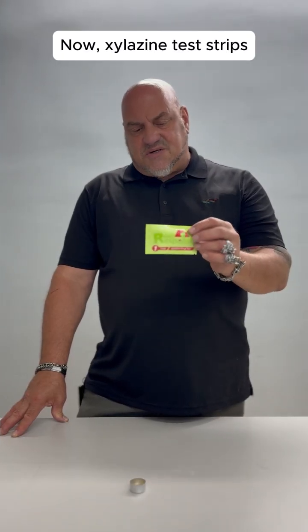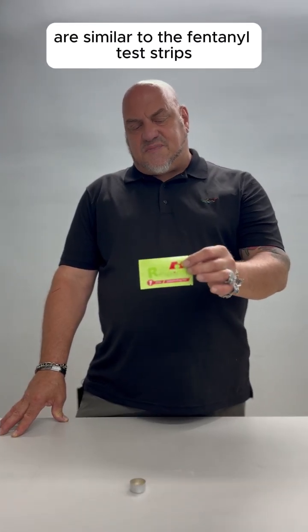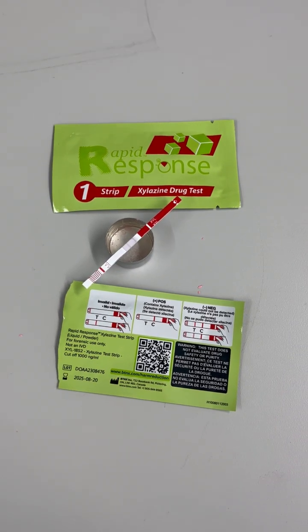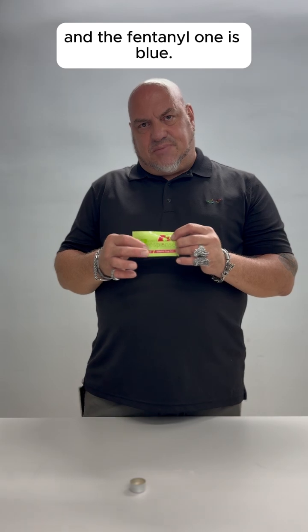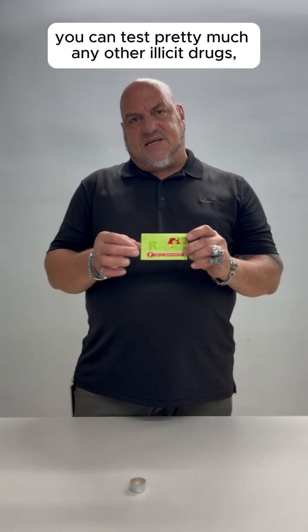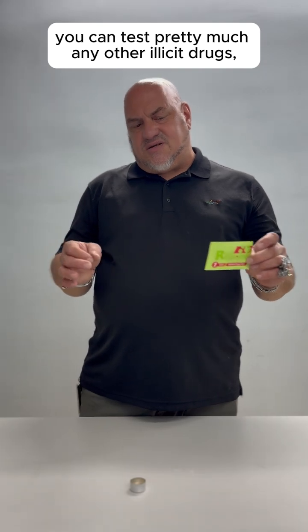Now, xylazine test strips are similar to the fentanyl test strips, except that you'll notice that this one is red, and the fentanyl one is blue. Also, where fentanyl test strips, you can test pretty much any other illicit drugs. The xylazine test strips is specifically designed to test dope.